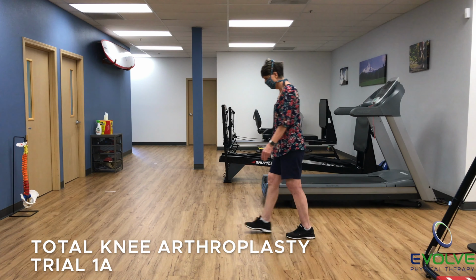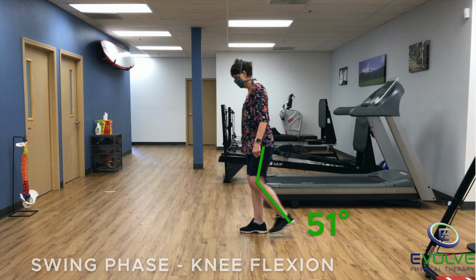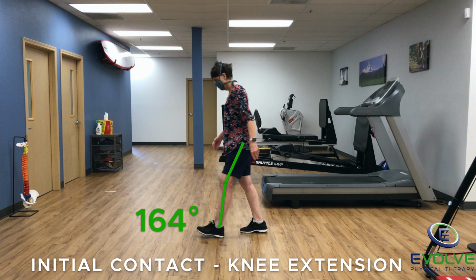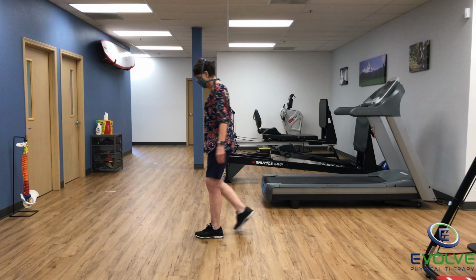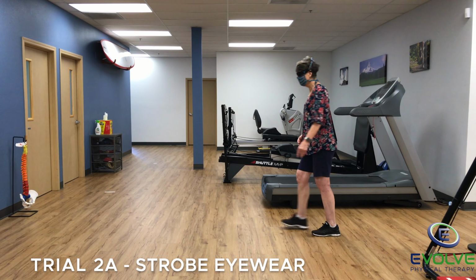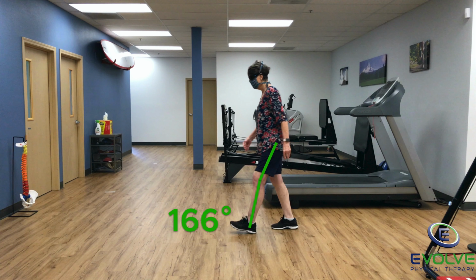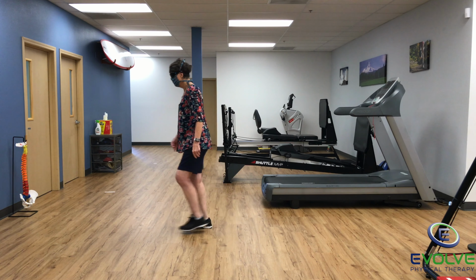Knee flexion is 51 degrees during mid-swing. And there is 16 degrees of knee flexion during initial contact. With the Strobe Eyewear, her knee flexion improves by 8 degrees during mid-swing and 2 degrees during initial contact.